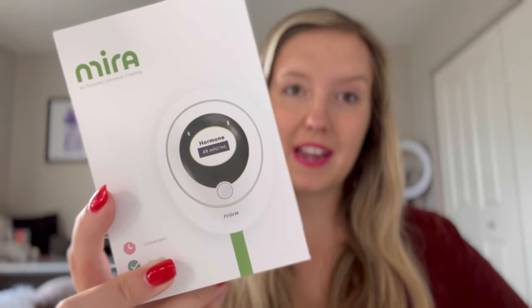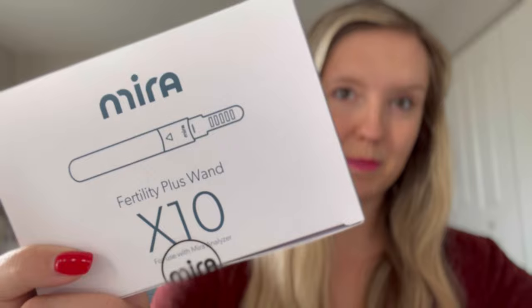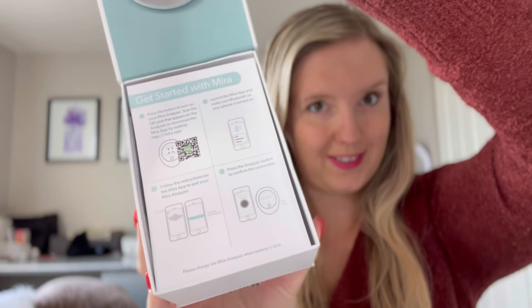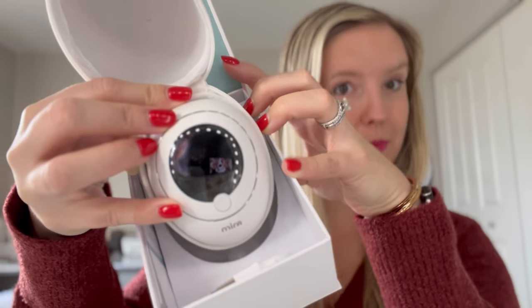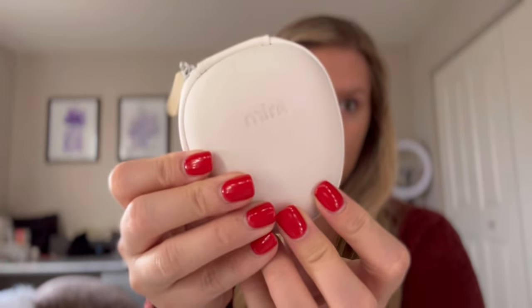I'm going to open the Mira Analyzer and show you the different features. Inside, you have a really convenient Get Started with Mira guide. Then you'll see the actual Mira Analyzer with a really nice soft shell case to keep your very important device protected throughout the duration of its life.